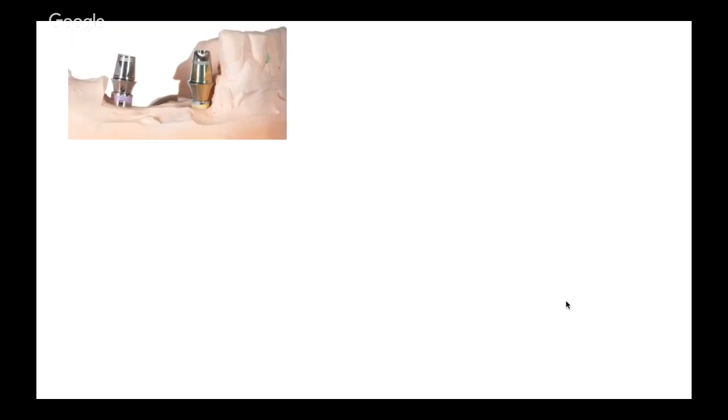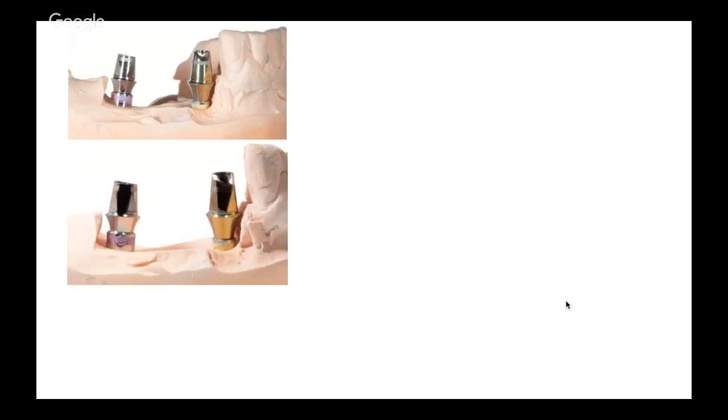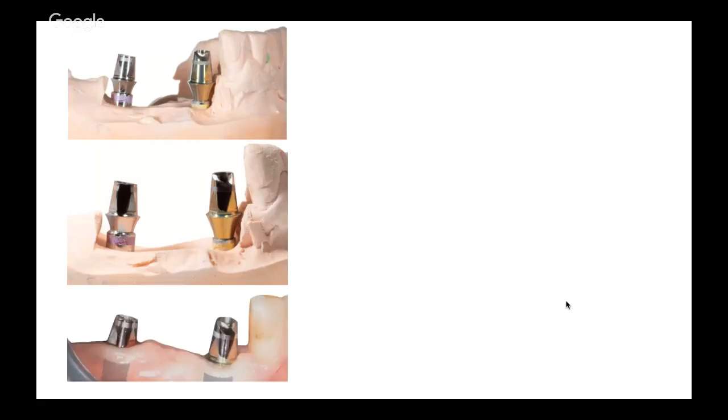It's a model. We made an impression, and we choose the abutments and make a restoration on it. What will we do in the mouth? First of all, we have to draw a line on the buccal side of the abutments. And while transferring this abutment to the mouth, we want to see that line exactly matched when placed in the mouth. If you see this line in the same position, we will know that the abutment is in the same position exactly as in the model.